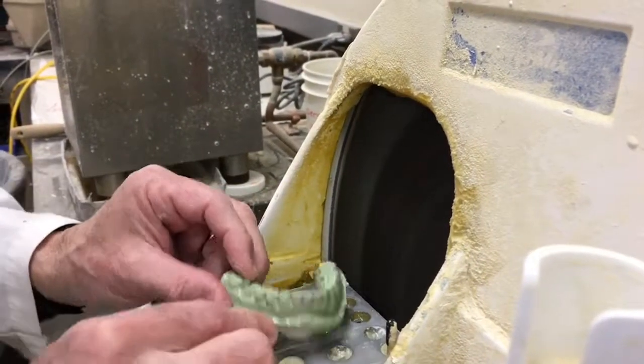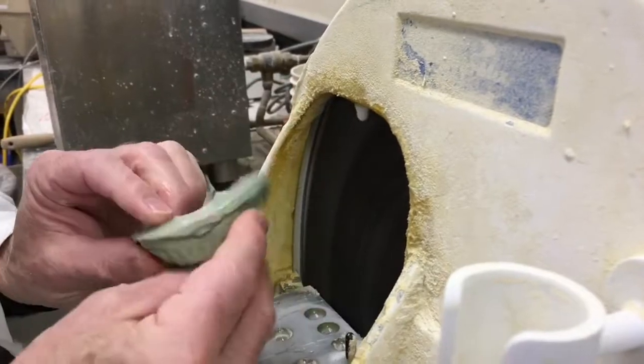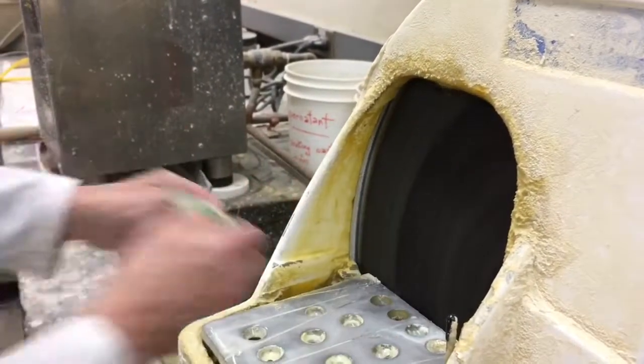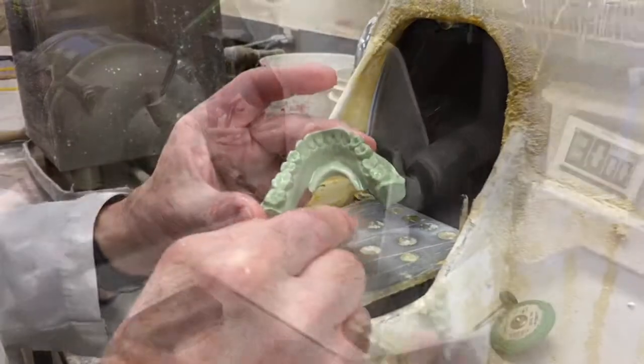Don't trim into your teeth. The base is flat — if it's not, take it down until it is, until you can see the striations of the model trimmer. Rinse it off again, and we're done. We're ready to pin it next.